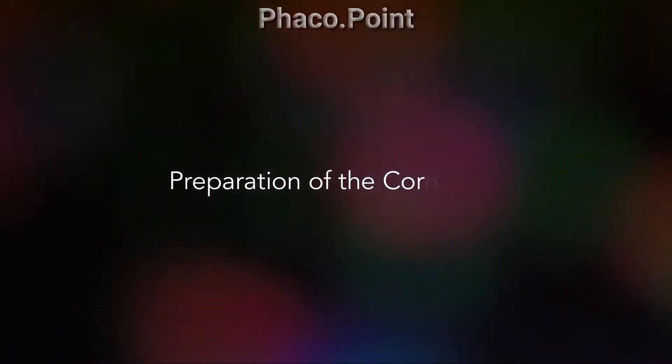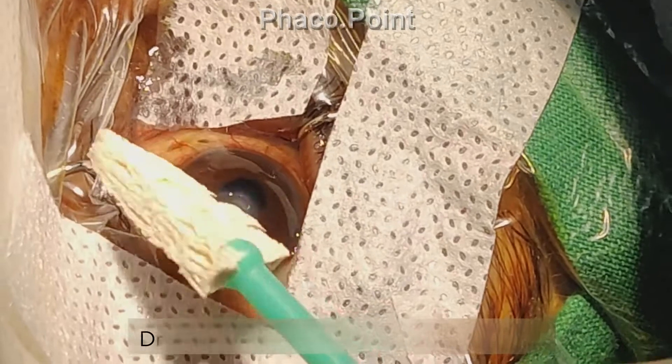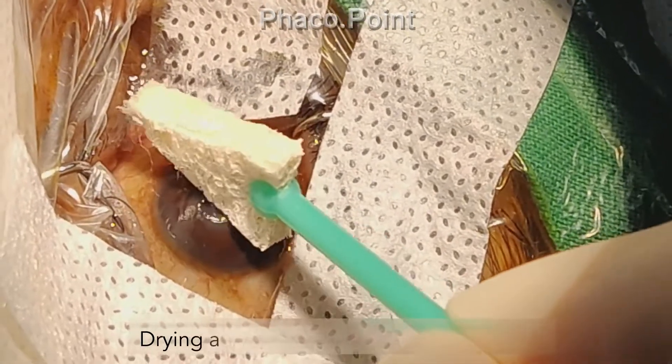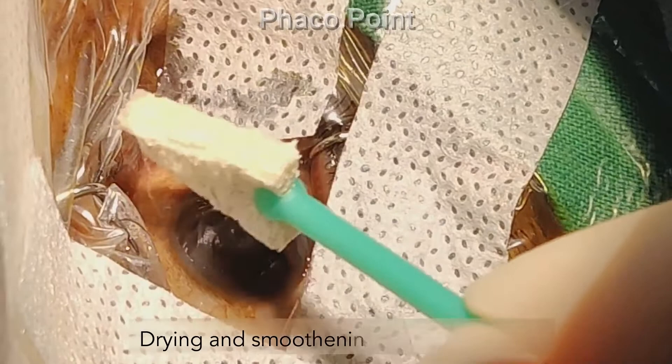We move to understanding the preparation of the corneal bed prior to the application of the cyanoacrylate glue. First, we need to de-epithelialize some of the epithelium in the area surrounding the corneal perforation.